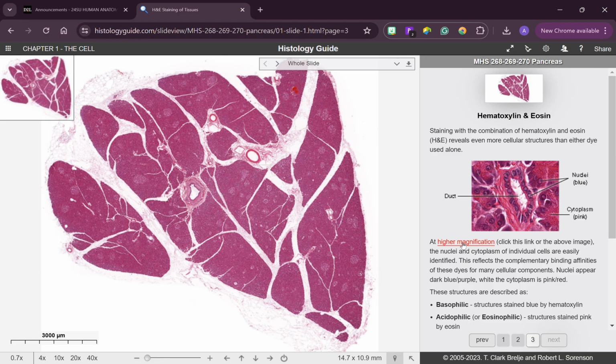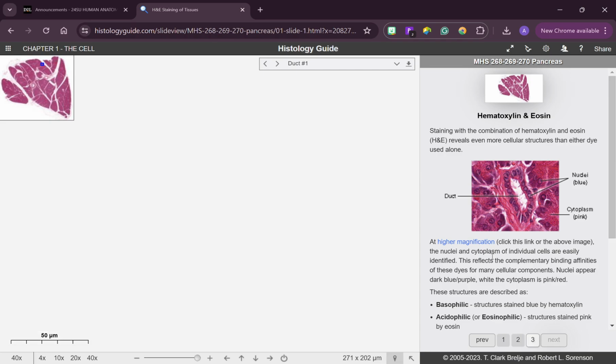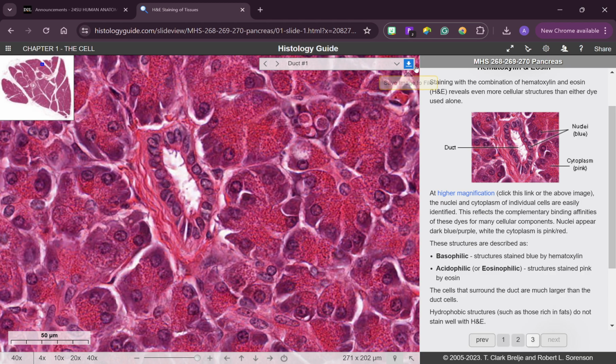Oh, and look at this. Here's a link that brings me right to something that I may want you to look at on the slide, as the link doesn't load and I say this. But this is just to let you know that we have a designated microscope. It is not random. It has preset magnifications. You have to know how to move around on the slide. You have to know sometimes how to take measurements, which we will do in a lab. And you also sometimes have to know how to download it.